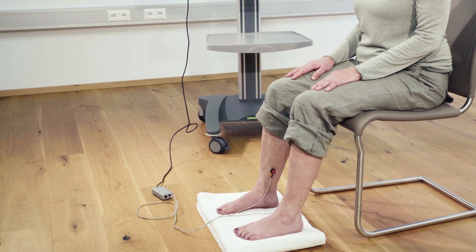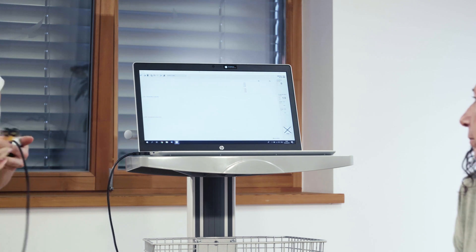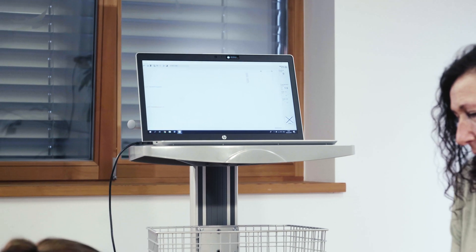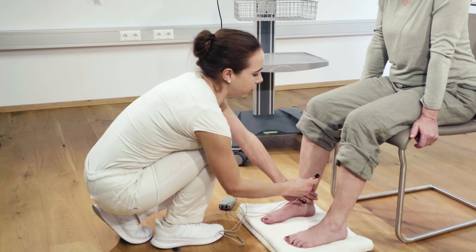simply plug it into the USB port of a computer. The measurement is made on the seated patient. The patient should sit down for at least two minutes in order to achieve a stable circulatory situation.